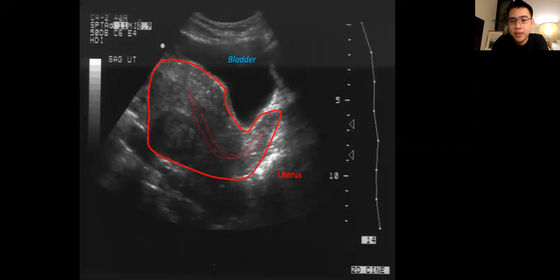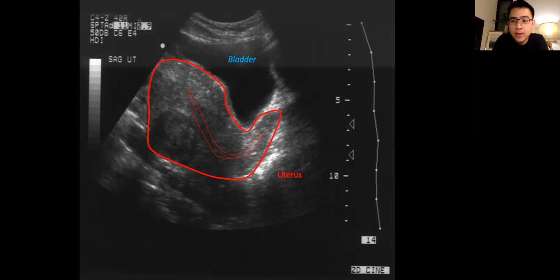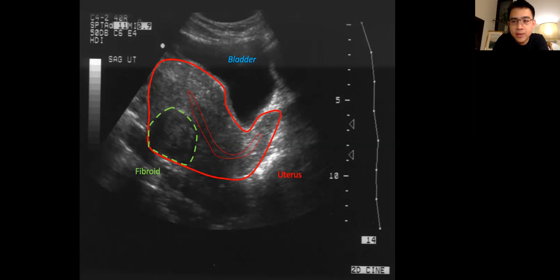This is a picture of an ultrasound performed transabdominally. The bladder provides a very good window to reach the uterus, which is why we often ask patients to drink lots of water before a transabdominal ultrasound scan. Here you can see the uterus and the endometrial cavity within the uterus, and in the posterior wall there is a uterine fibroid, which tends to appear darker compared to the rest of the uterus.